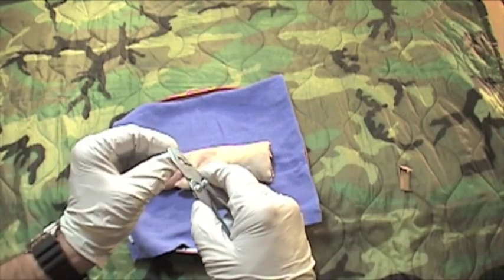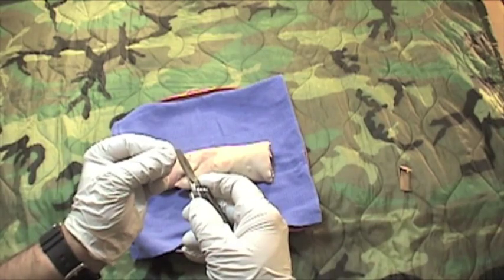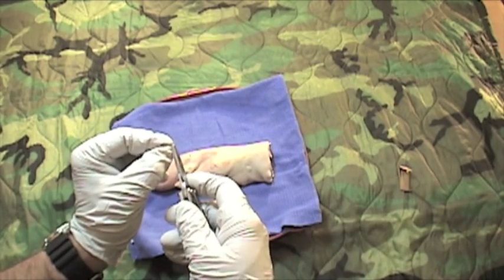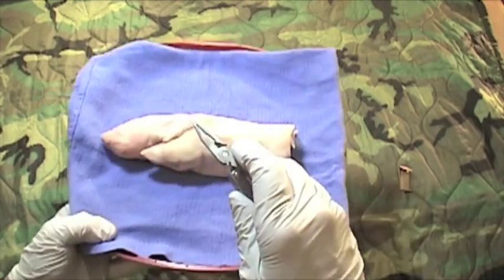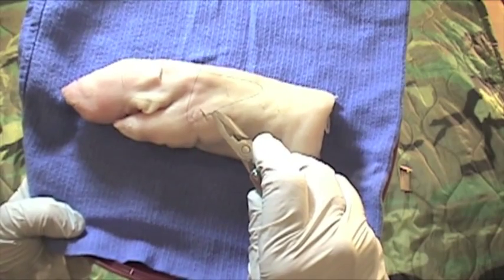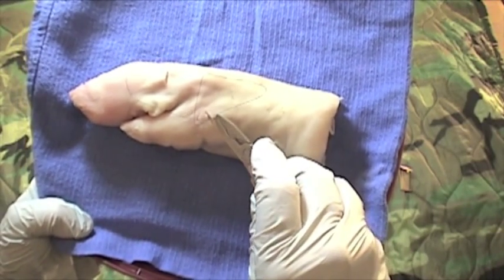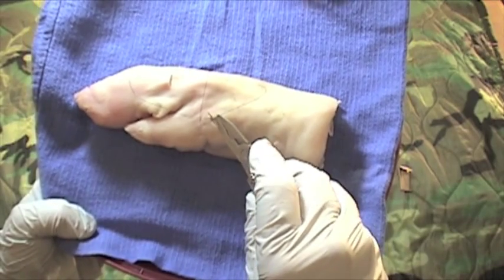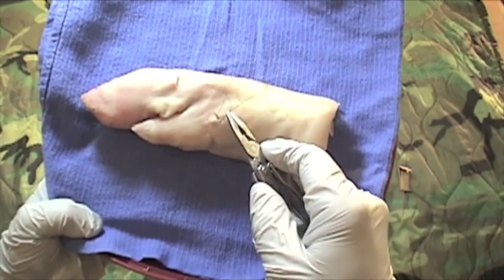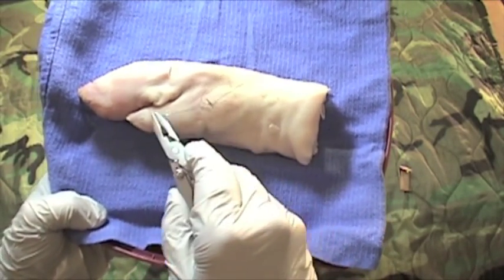At this point, we're going to reload our needle driver. We're going to grab again at the back, at the junction of the front two-thirds and rear one-third, and we're going to continue driving this needle through the other side of the wound exactly across from the first place of entry. Then we're going to bring it up and grab it with the needle and pull.